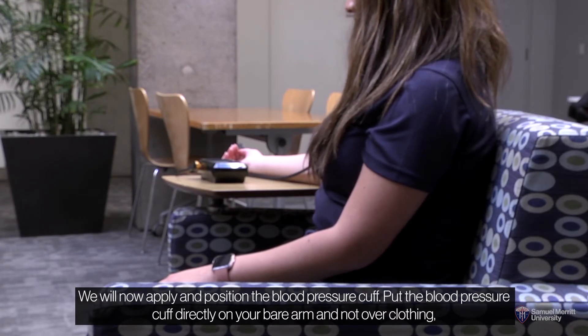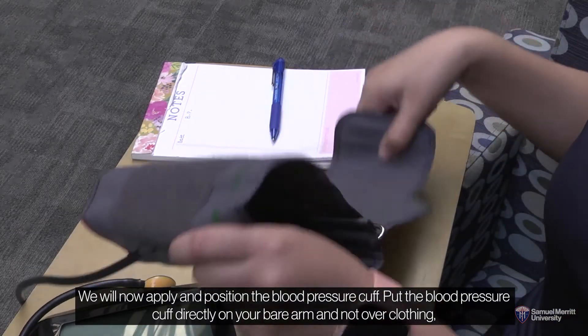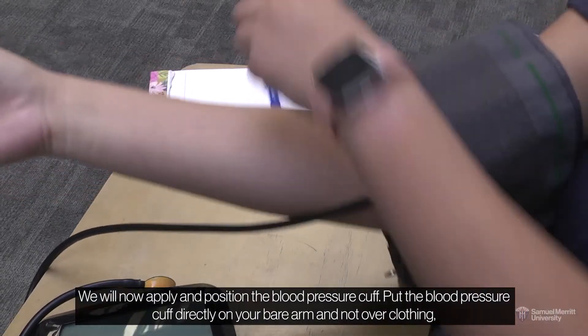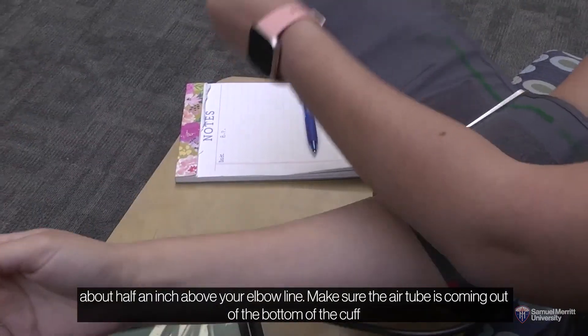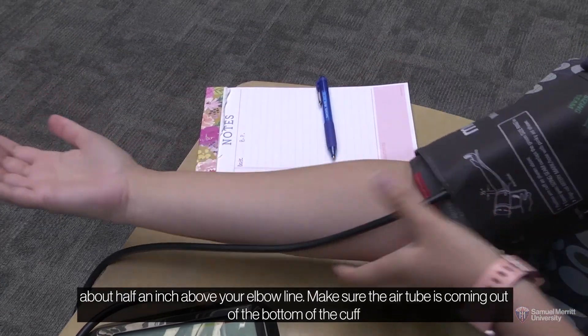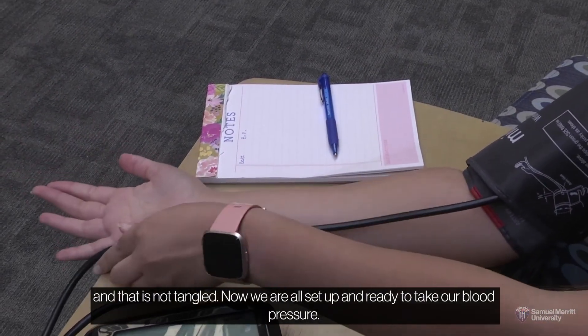We will now apply and position the blood pressure cuff. Put the blood pressure cuff directly on your bare arm and not over clothing, about half an inch above your elbow line. Make sure the air tube is coming out of the bottom of the cuff and that it is not tangled.